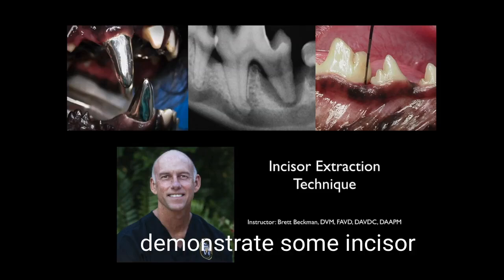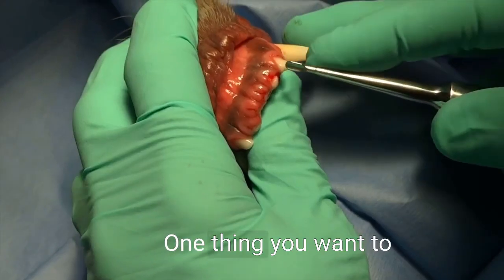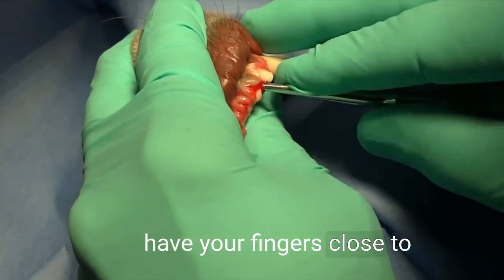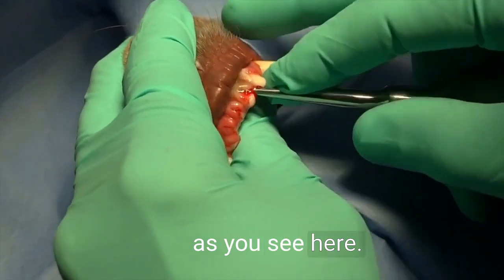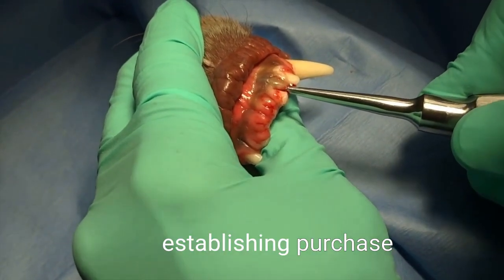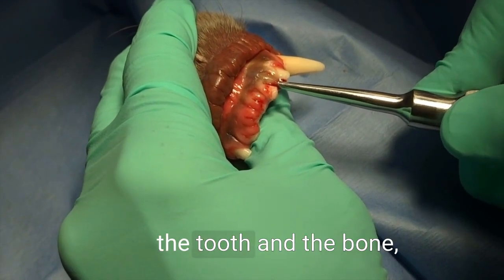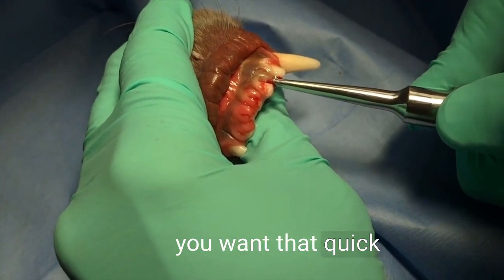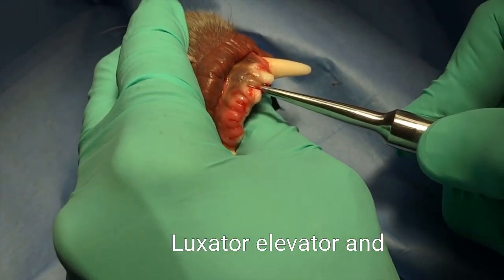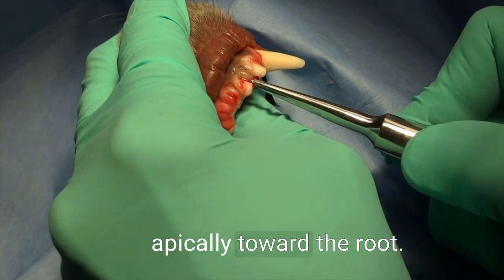We're going to demonstrate some incisor extraction techniques. One thing you want to keep in mind: you want to have your fingers close to the end of the instrument, as you see here. When establishing purchase within the periodontal ligament space between the tooth and the bone, you want that quick activity — wiggling the luxator, elevator, then directing it apically toward the root.